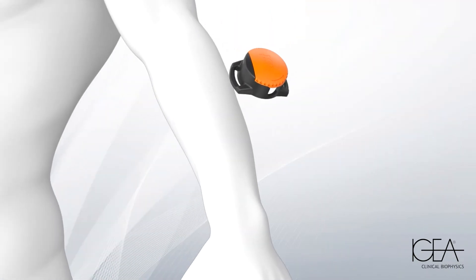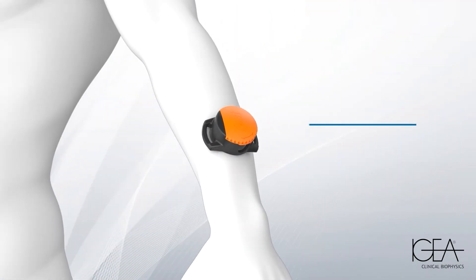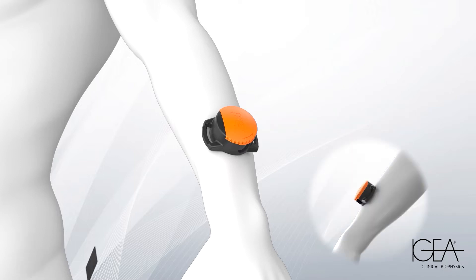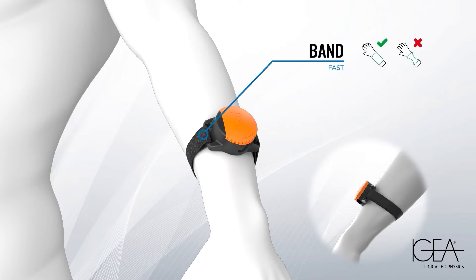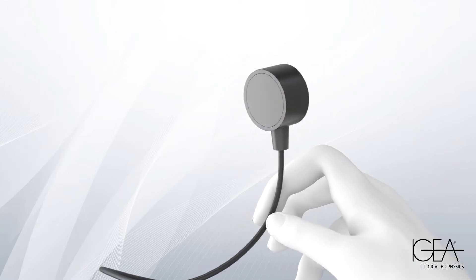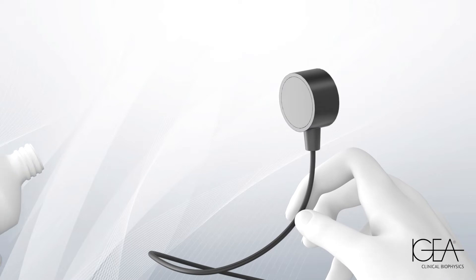Remove any braces before positioning the transducer holder on the area to be treated. The holder requires direct skin contact. Secure it with the supplied band without over-tightening. Apply the gel evenly to the transducer on the side without any writing.